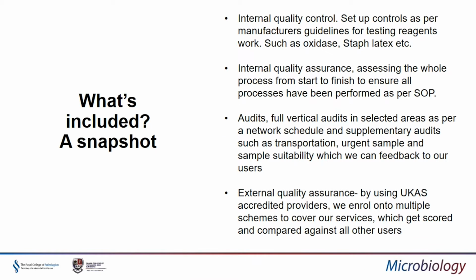We undertake audits, so we do full vertical audits in selected areas as part of a network schedule, and supplementary audits such as transportation, urgent sample suitability, which we can then feed back to our users. And we also undertake external quality assurance. So we use UKAS accredited providers. We enroll onto multiple schemes to cover our services, which get scored and compared against all other users who are also registered to these schemes. But we also do cross-site comparability studies within Public Health Wales as well, so we can share best practice.